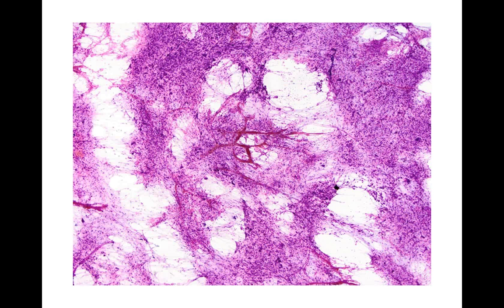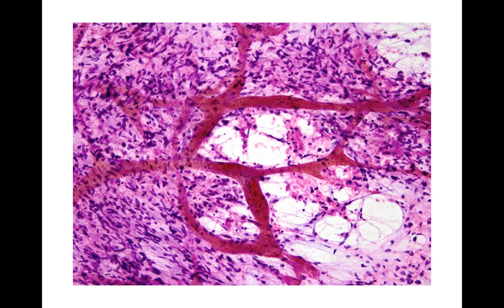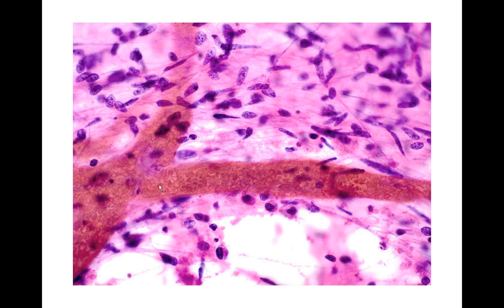So this is the intraoperative smear preparation from the biopsy that the neurosurgeon gave me. And as you can see, this is a lower power view compared to the lower power view of the white matter. Really, really nasty stuff. Lots and lots of blue cells here. Very proliferative. Lots of big, tangled, complicated blood vessels. These are blood vessels. You can even see the individual red blood cells coursing throughout here.